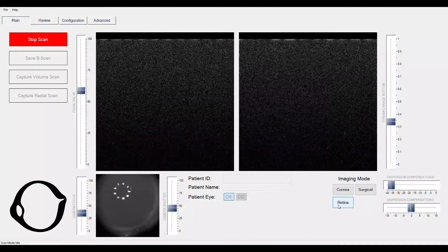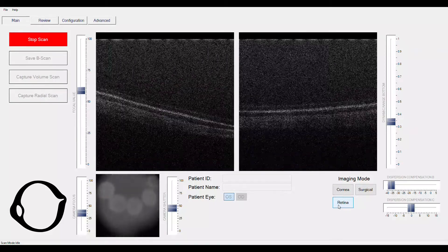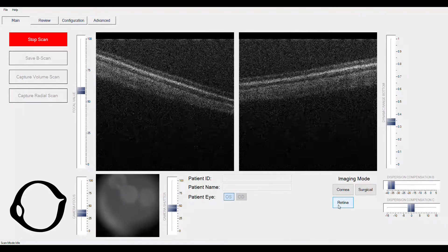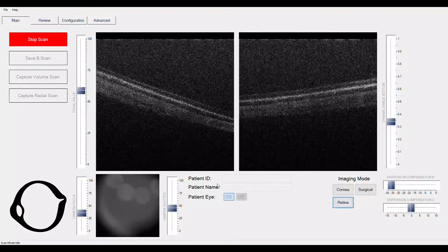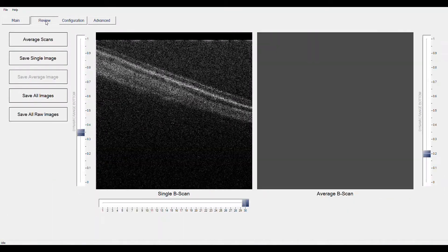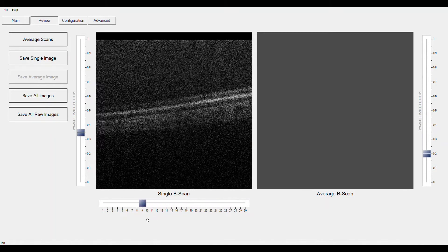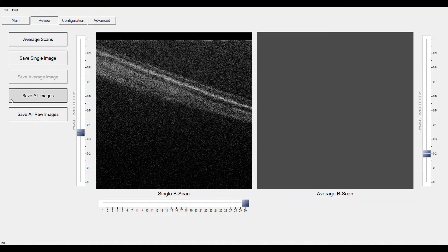With one click of a button and advancing the scanner head forward, you can see how easy it is to acquire retina on screen. The screen will show you both horizontal and vertical images at the same time. If we stop our scan, we can now review the images that we have captured. We can select any single image controlled by the lower slider, or save all of the images captured.